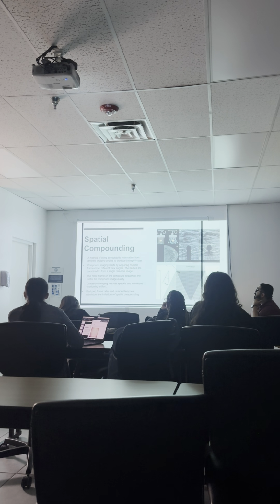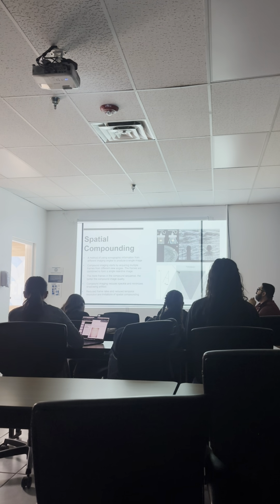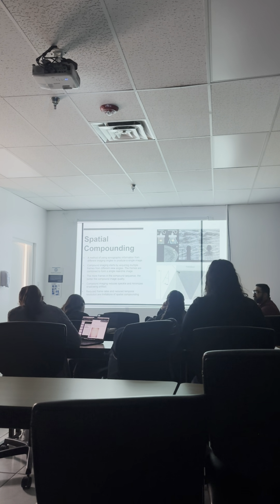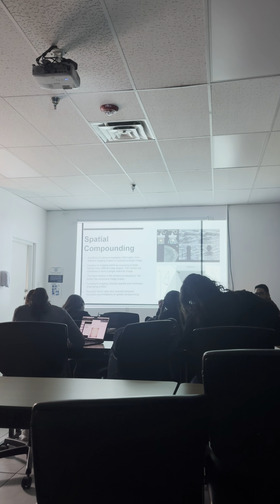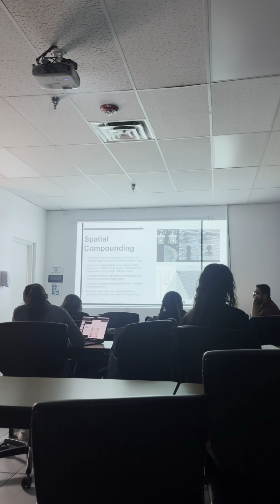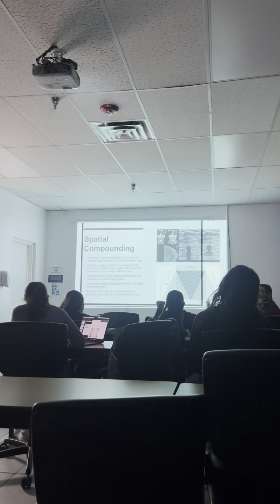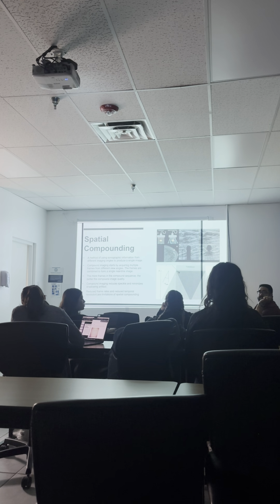Okay, so spatial compounding reduces the frame rate and will reduce the temporal resolution, because frame rate and temporal resolution have what type of relationship? Directly related. Okay, so why would our frame rate go down? Because the resolution goes down. Well, why? There's less frames per second. Why? What are we doing? Put it in angles.